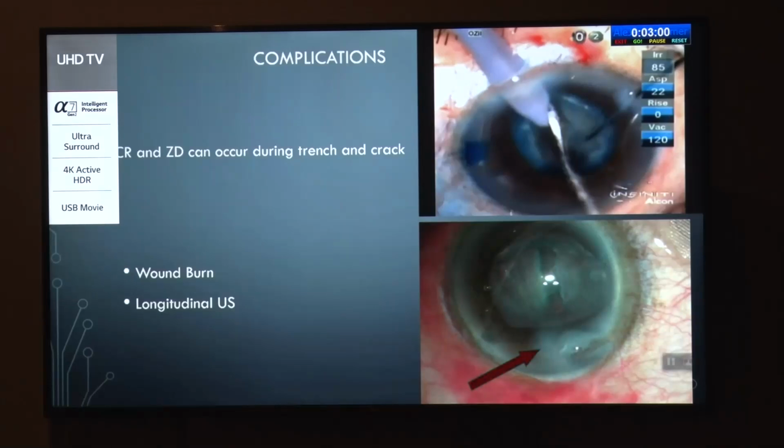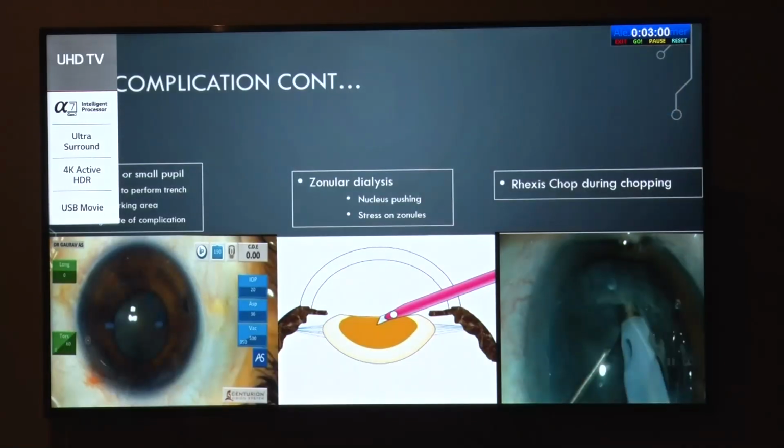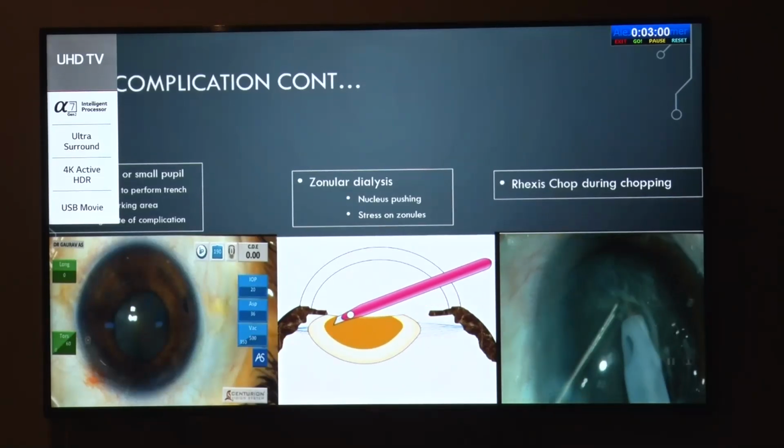Since longitudinal ultrasound produces more heat energy, 64% more than the torsional, there may be chances of wound burn. In small pupils with shallow AC, where it is difficult to put expanders and the working area is limited, with high chances of complications and more maneuverable processes, it becomes a cumbersome process. We do not get an idea about the rhexis margin, which may tear while doing the surgery.